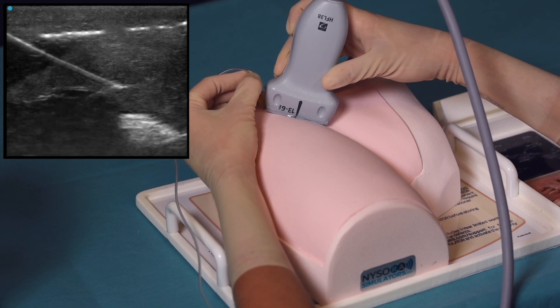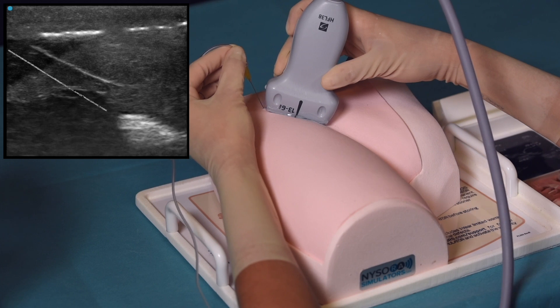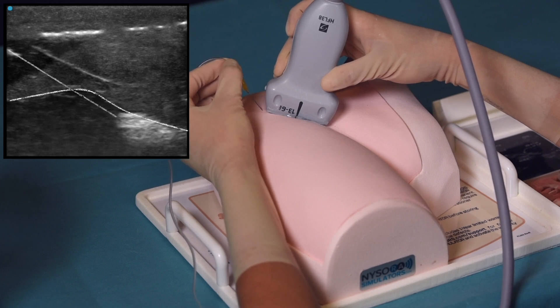Moving the transducer or slightly tilting it eliminates needle tracks from the image. Also, the needle tracks disappear within a few hours after use.